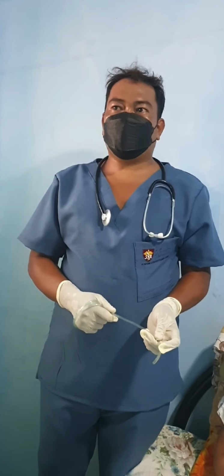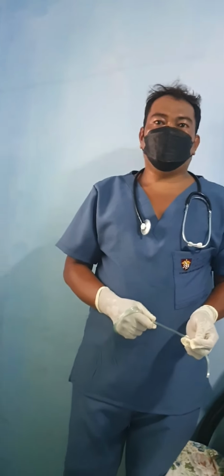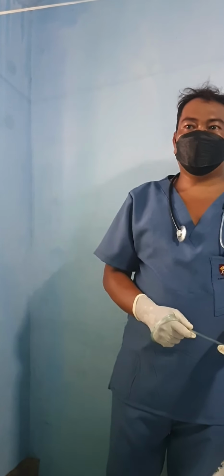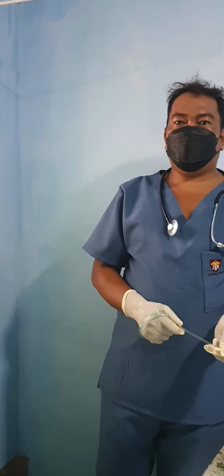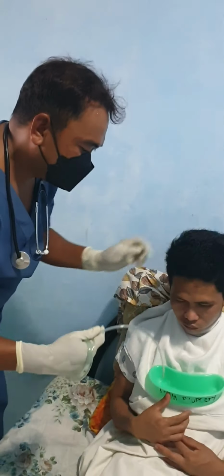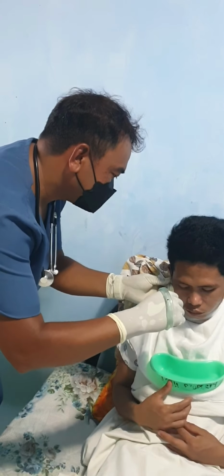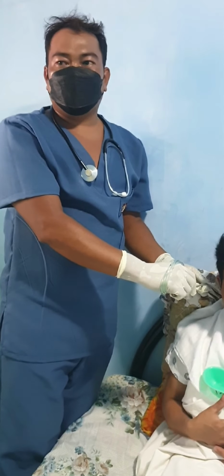Insert the NGT tip slowly into the patient's nostril and advance it steadily in a downward direction along the bottom of the nasal passage, pointing toward the ear on the same side as the nostril. This follows the natural anatomical alignment of the nasopharynx. You may feel slight resistance as you advance along the nasal passage.